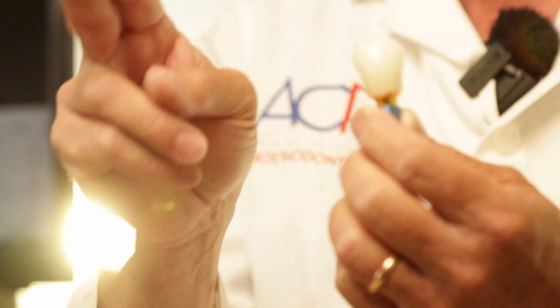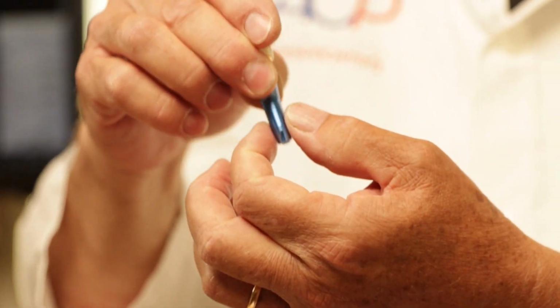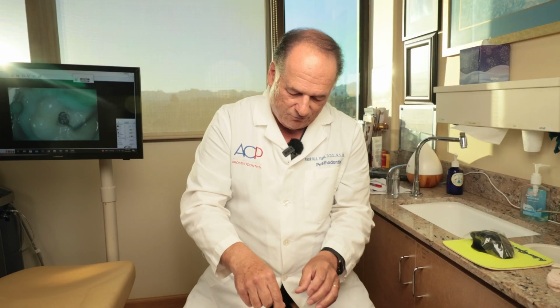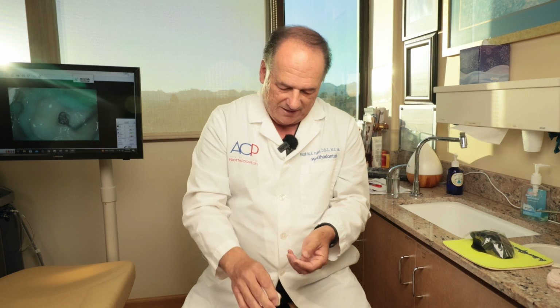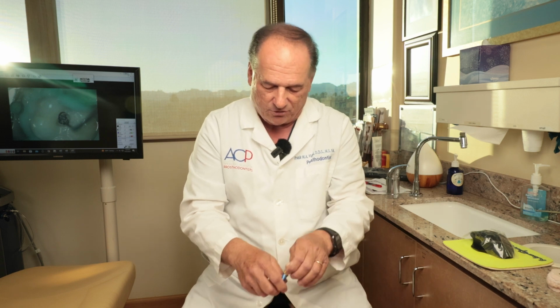You're talking about two different things. There's the lifespan of the portion that's within the bone, and quite frankly, we don't know what that lifespan is right now. It could be for decades potentially. What's the lifespan of the crown and the component that holds the crown onto that implant?